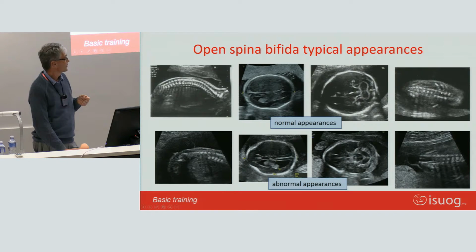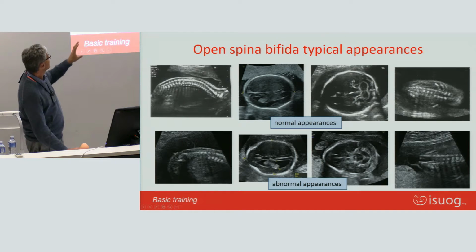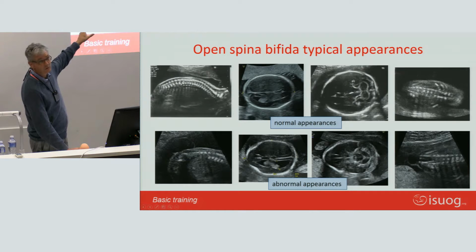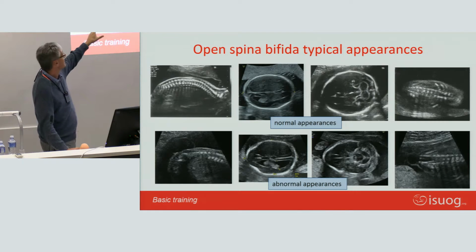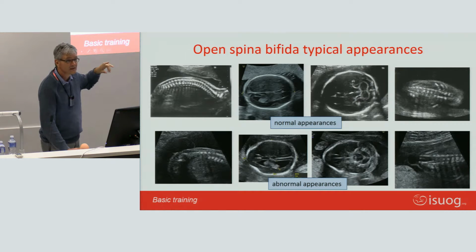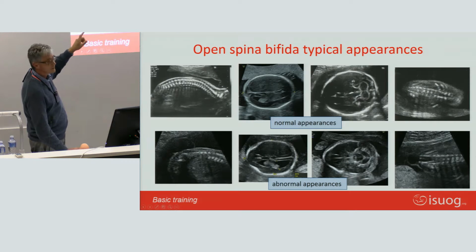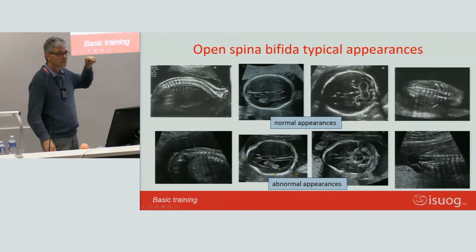And here they show you the coronal views, which can be useful if you know there is a spina bifida to detect. But these are the sagittal views that are really the way that you should see. And this is really what the baby should lie like before you can send her out and say this baby's spine is normal. The spine anterior, you see it right down to the tip of the coccyx. What I'm missing on this slide, where are the ISUOG people, is actually showing the conus medullaris, where you see the bottom tip of the spinal cord.